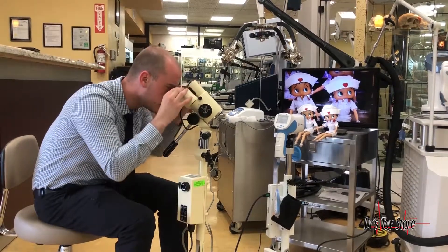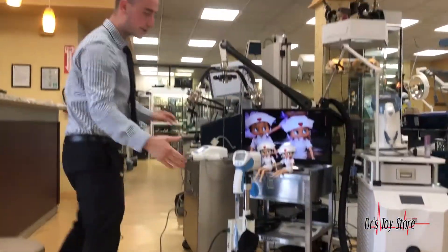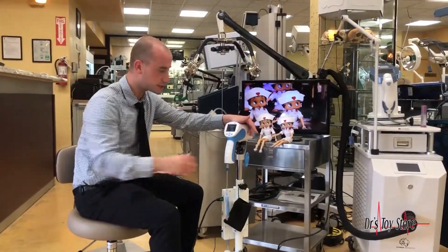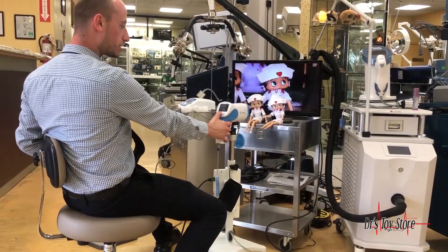With a manual colposcope you have to sit there, focus the light, and move the arm. With a video colposcope like this, you're actually not sitting there trying to focus the light — you have it focused for you. It's an autofocus and zoom feature that lets you sit back and see what you're looking at just like that.